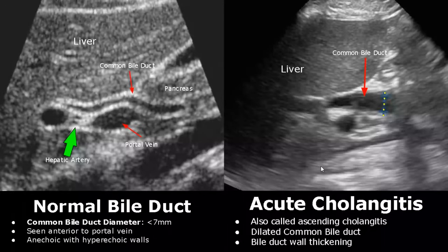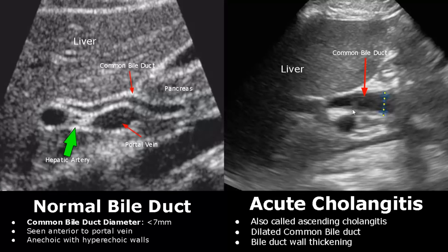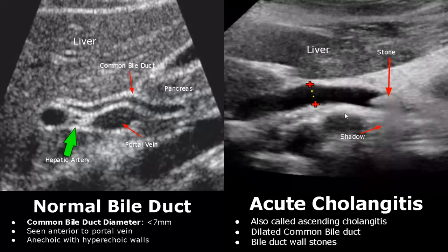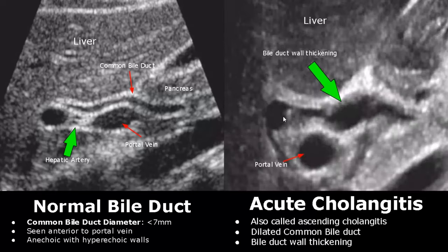Cholangitis is the inflammation of the bile ducts. In acute cholangitis, also called ascending cholangitis, the common bile duct is dilated and the bile duct walls are also thickened. In this image we can see a stone in the bile duct with posterior shadowing causing inflammation, and the bile duct is dilated. Here we can see thickened walls of the bile duct — in normal wall thickness these internal echoes are not seen, but in thickened walls they can be seen inside the bile duct.